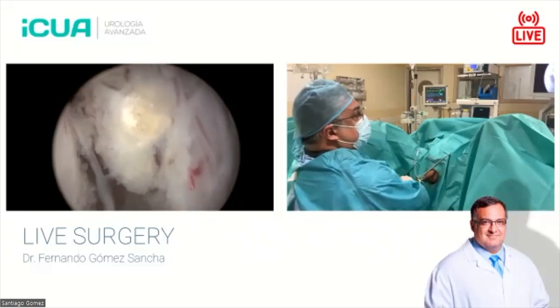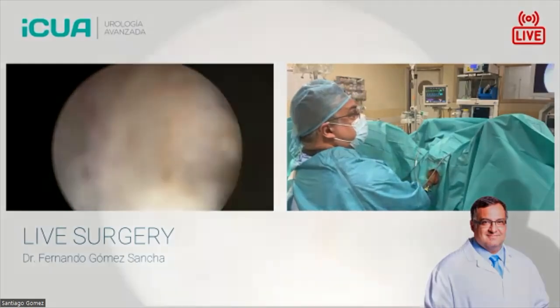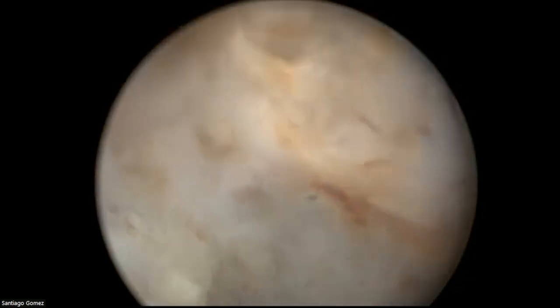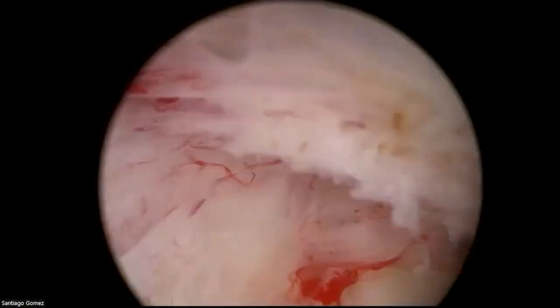And now we are coming, you see, a little bit more here. For example, it looks like a nodule. You see, it's a little bit yellow. So we have to correct the plane again. We want to take the nodules out. This happens, as I say, in the best families. So if you see that there is a residual adenoma, it's nicer to go in and try to take it out.